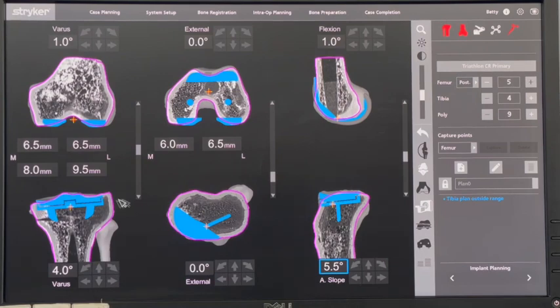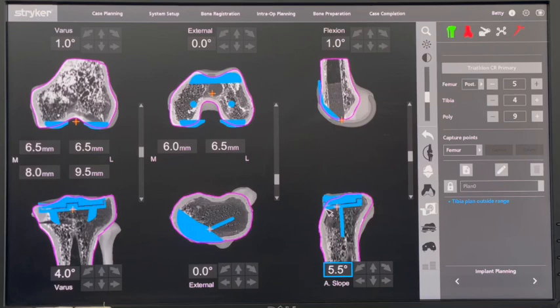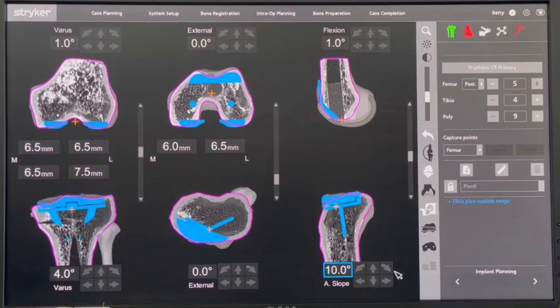The planning screen of the sawbone shows 4 degrees of native varus. The inferior aspect of the tibial tray in its atypical position acts as the surrogate for the osteotomy plane. For our purposes, the keel of the implant does not apply. We can move the base plate of the tibia in 3 planes as shown to set the appropriate hinge point and 2 cut planes for the osteotomy.